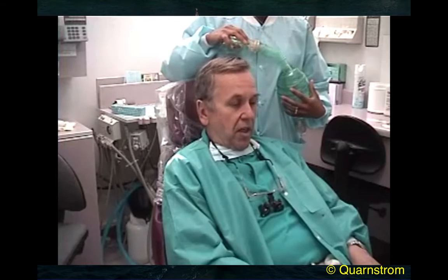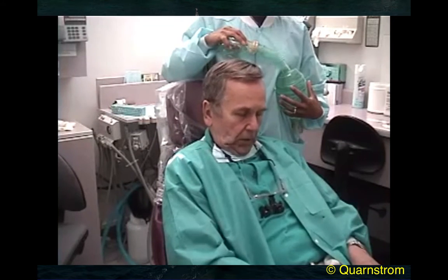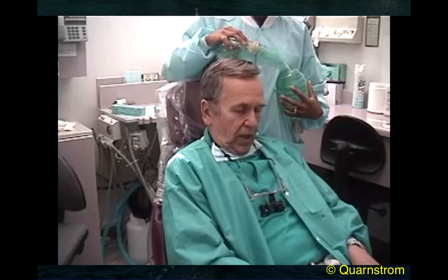So the first thing you do if you're going to have your staff breathe for you is start out in this position, because that's probably where the unconscious patient would be, with their chin down and their airway occluding. At this point, Essence is going to take over and open my airway and give me a breath.